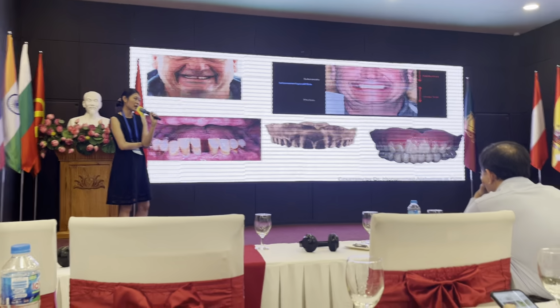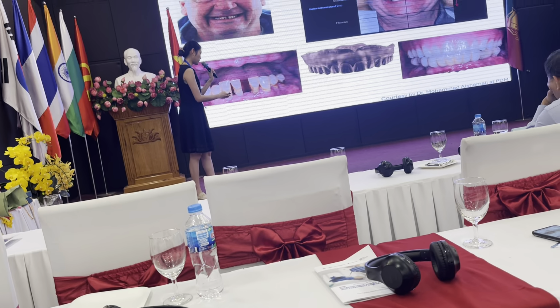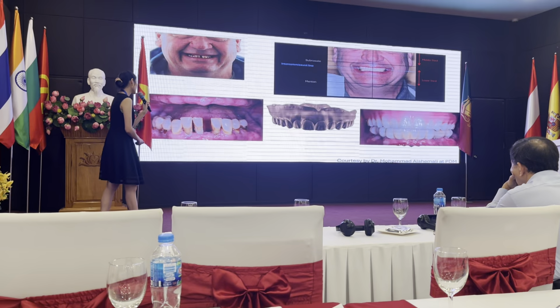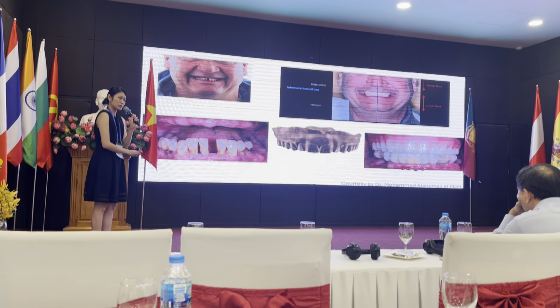And here's another case that is about a removable prosthesis. So this is actually one of our lessons cases. As you can appreciate here, in the mandible we have severe periodontitis, and the maxilla is completely edentulous.